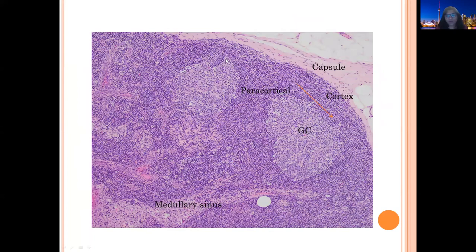This is a higher power view of the lymph node again. These are germinal centers, this is cortical tissue, paracortical tissue, and medullary sinuses. There is a nice capsule on the outside.